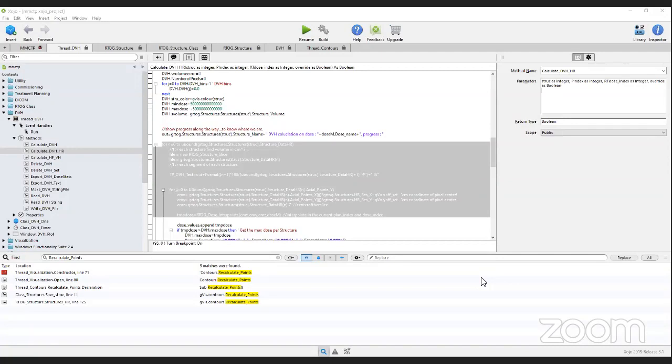The problem I see, for example, is if different companies have different ways of calculating DVHs, then if you want to compare, let's say, a plan from Eclipse compared to MMCTP, one has to be consistent, has to recalculate DVHs in a consistent way. So I agree, probably we cannot import the DVH from Eclipse and compare them to what is calculated with MMCTP. Probably right. There are going to be small changes, and especially when the volumes are small, probably that's where we're going to have a big discrepancy.